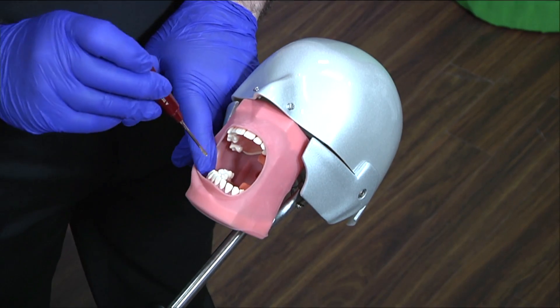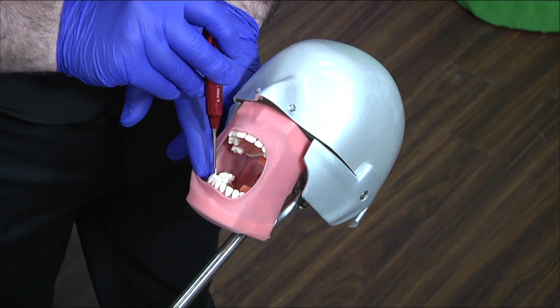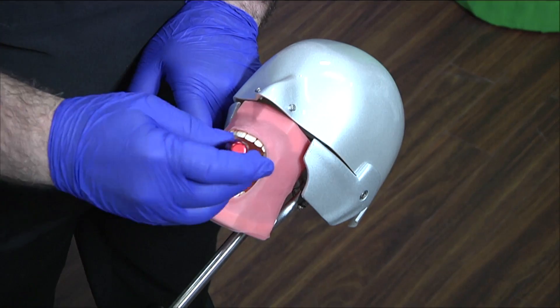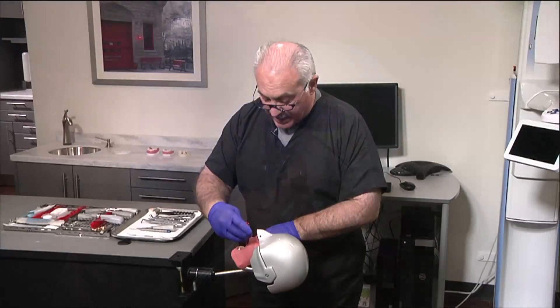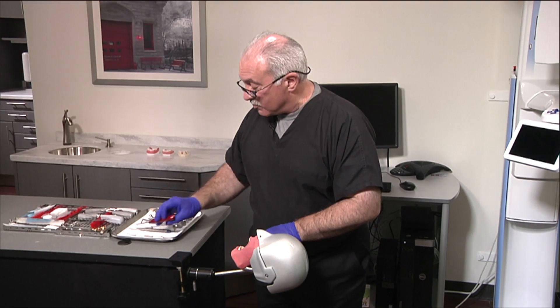Let's drop down to a mandibular arch — let's say it's the second premolar. I'm doing the exact same thing: apical pressure. You can come from the lingual and be as vertical as you can. And your assistant does not have to contort as well.